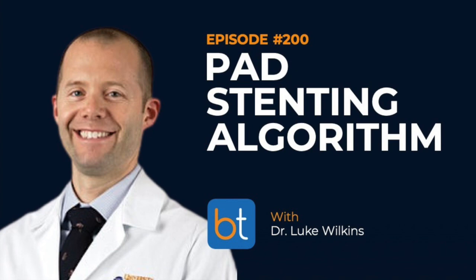I misspoke. Yes. So when you're coming from the below, you can pass a wire into the subintimal space from below and then have those two wires meet within the middle. Sometimes you can be so lucky as to have the retrograde wire go into the antegrade catheter and then go all the way out through the catheter tip.